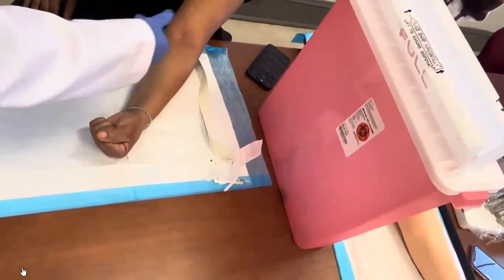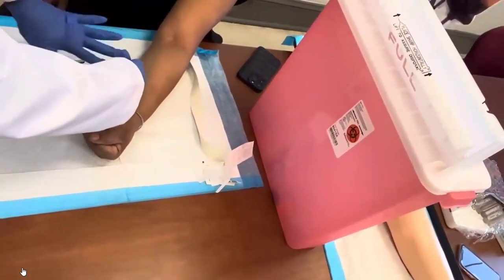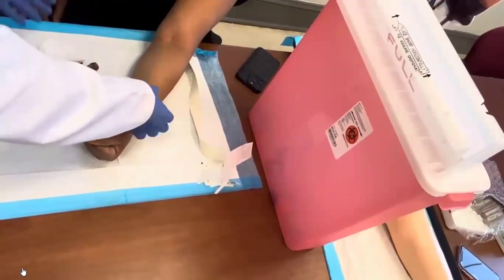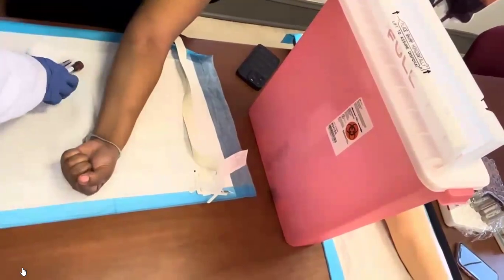So in my case, I'm right-handed. I'm going to stick with my right hand. So I'm going to make sure all of my supplies are on the left side. Scoot up for me a little bit. Sure. All right. So now I got everything ready.